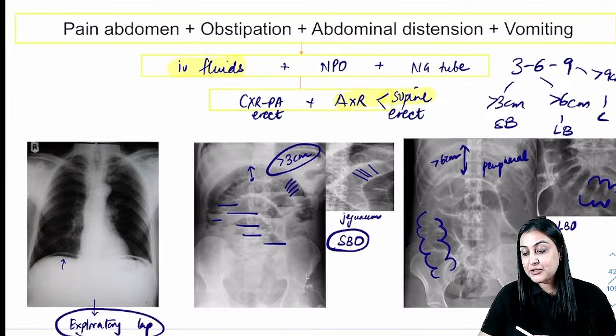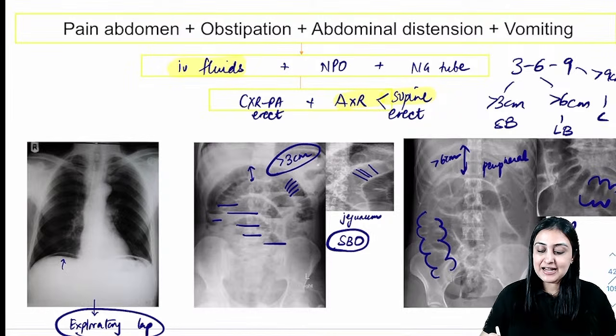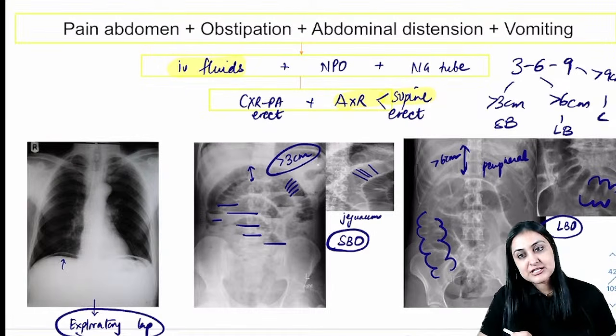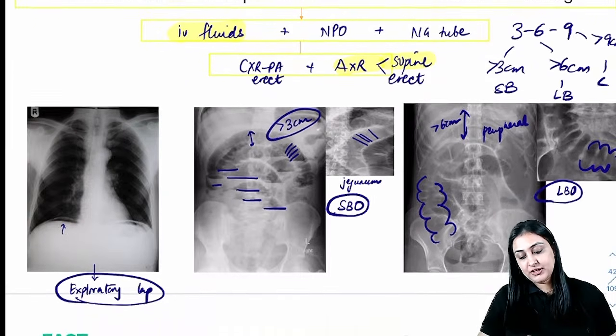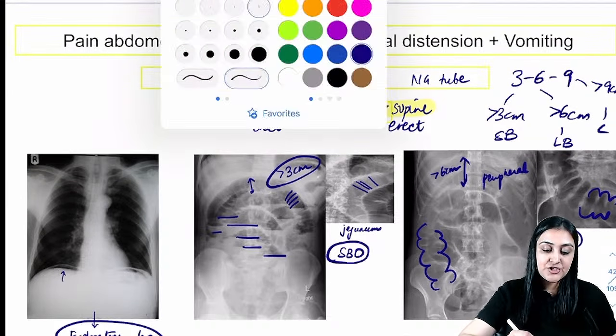Okay. Incomplete haustrations is normal. Yes, that is a normal feature. So we are identifying that this large bowel is dilated. Any loop which is dilated is the obstruction, right? So this is large bowel obstruction. Understood, everybody? How do you manage small bowel obstruction?